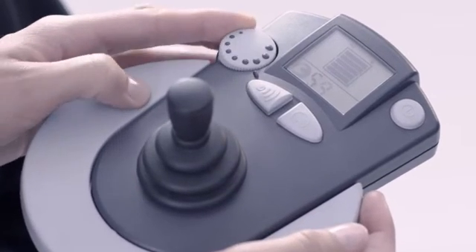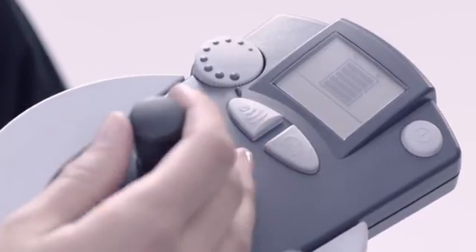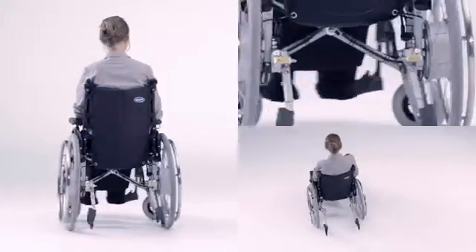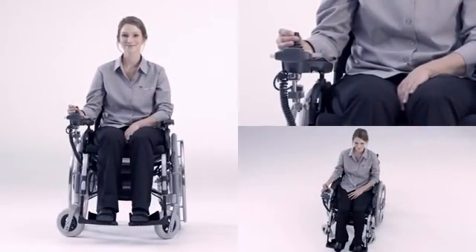The maximum top speed can be set as required at the twist of a button. Thanks to eFix, the wheelchair remains extremely manoeuvrable and will even turn on the spot.